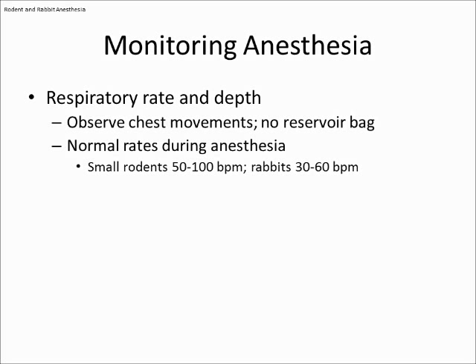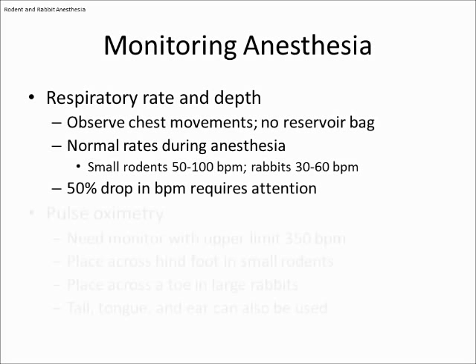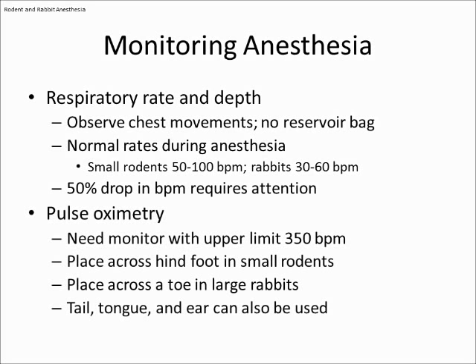Heart rates can be through the roof. This is very important. It doesn't matter what their heart rate is. It's going to be very, very high. But as the anesthetist, if you're going to be doing these, you just need to be aware of trends. As I keep telling you about trends, what direction are we going in, up, down, or lower? And if you suddenly see a 50% drop over time, that does tell you that something's going to happen. Typically, right after this is beep, so asystole, and then CPR time.